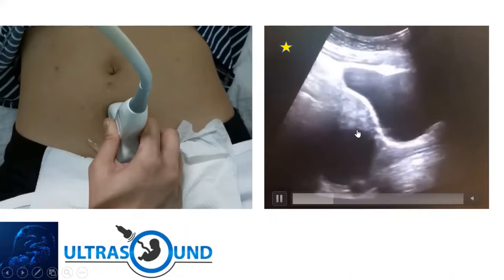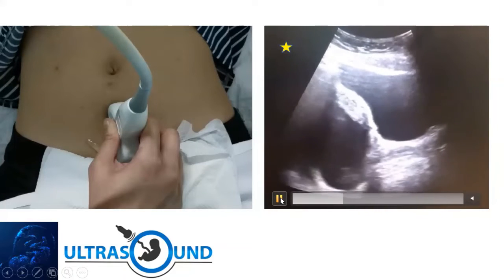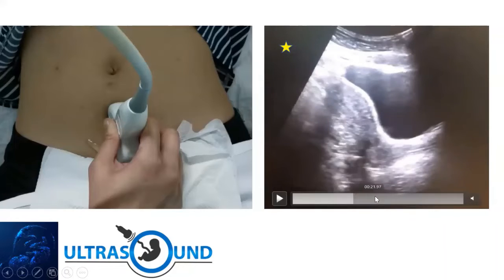All right. There's a mess there. There are abnormalities here. Do not straight away focus inside there. Come back, complete the assessment of your uterus before you focus on the abnormalities. Otherwise you will get distracted and you might miss out something. So sweep to the left and then come back to the center. All right, then you have finished examining your sagittal view of your uterus. Then you take whatever measurement that you want. So this is the bladder, the uterus, cervix, and the vagina.